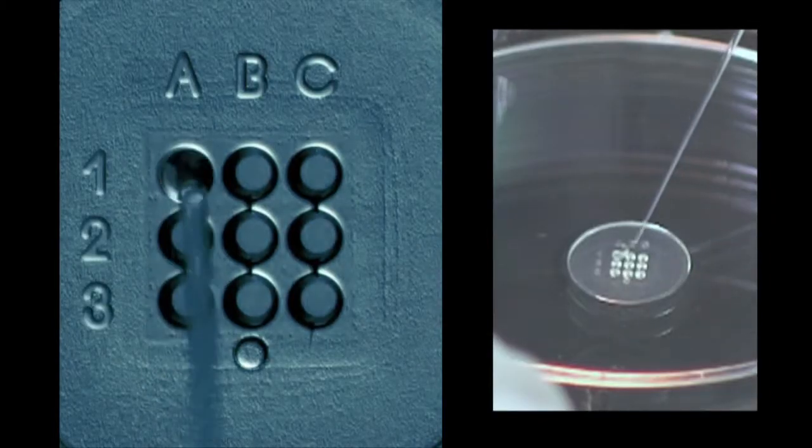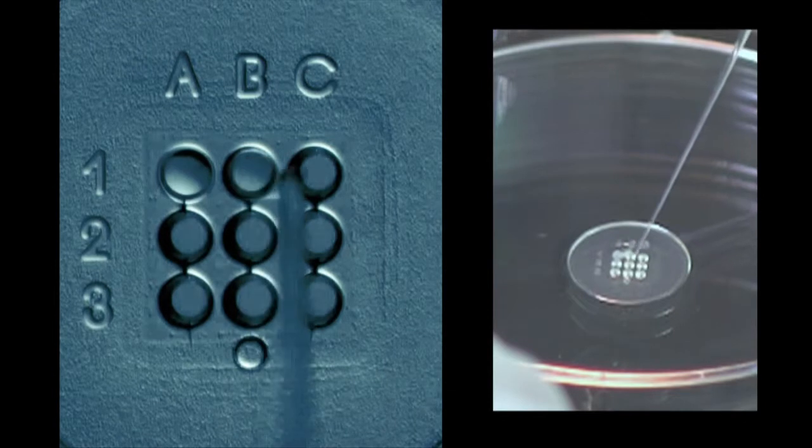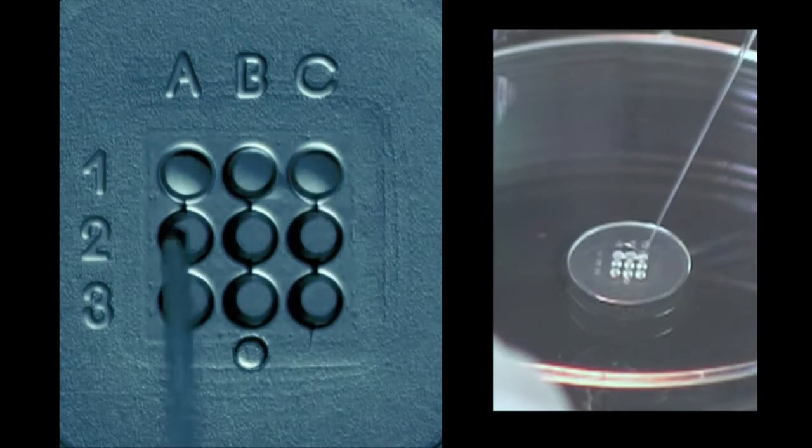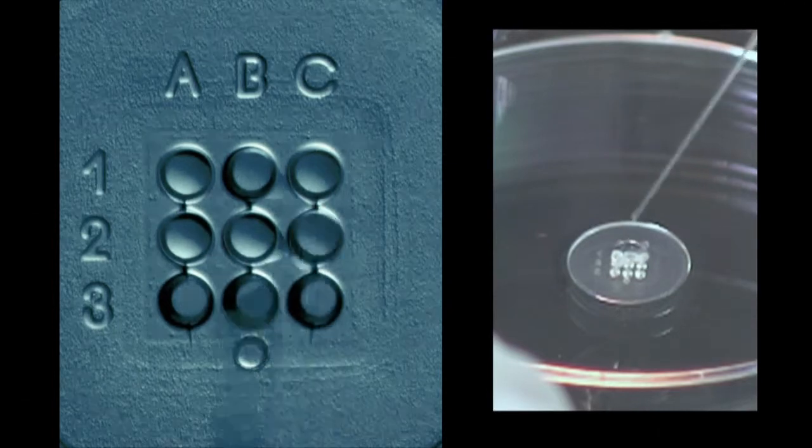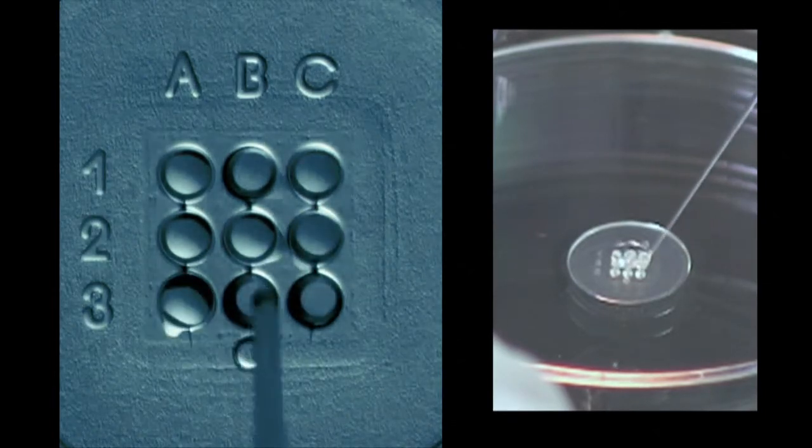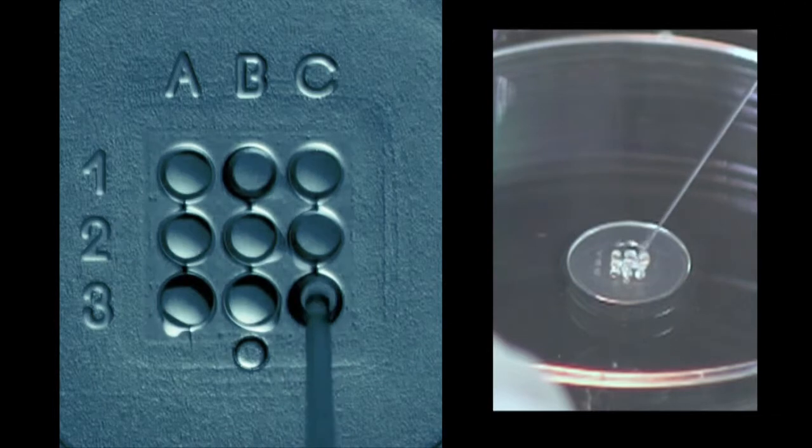To prepare your PrimoVision culture dish, load each well individually with GTL and then cover all of the wells with an additional 80 microliters of GTL. Make sure that you keep the droplet as flat as possible and avoid the formation of air bubbles.